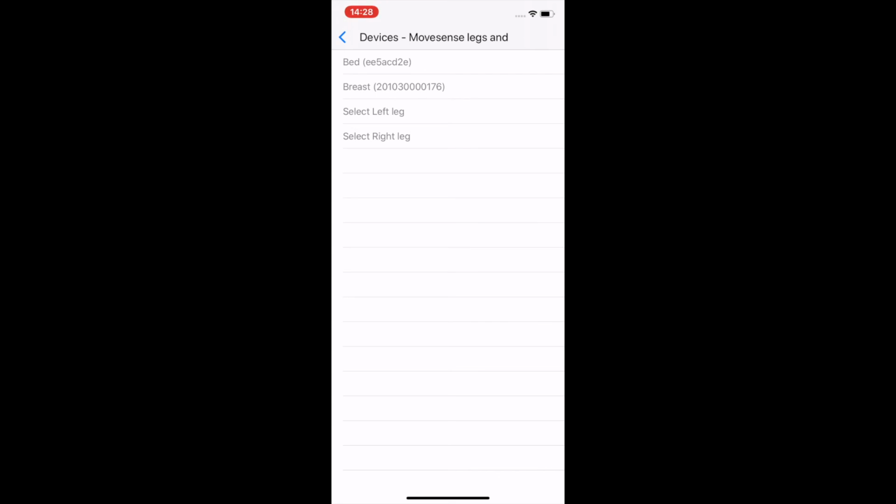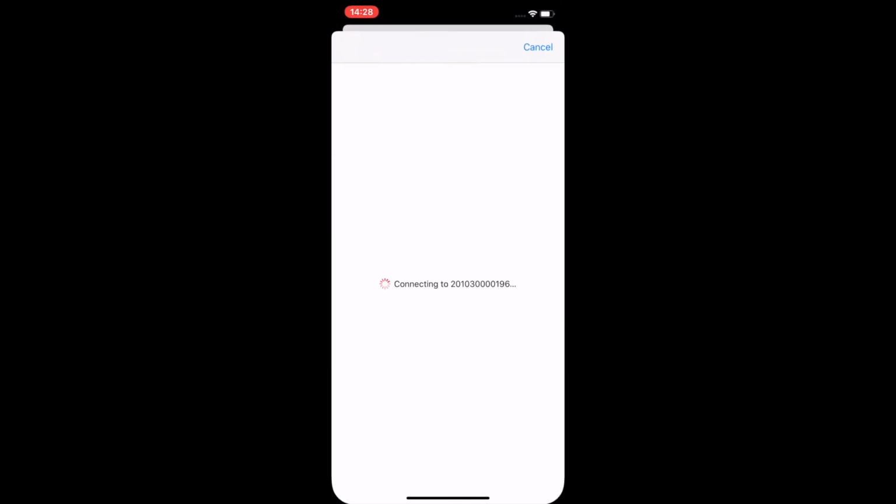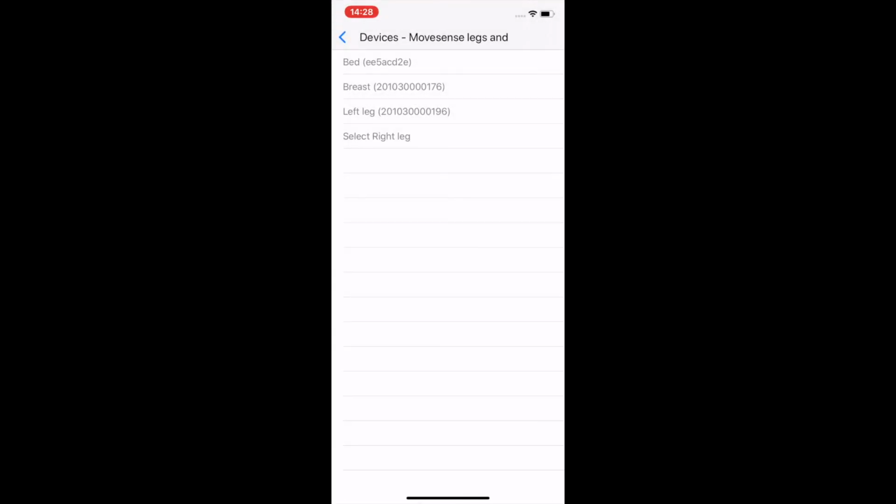Now we have to put a sensor on the left leg, and then after that we choose the sensor as well to get the data from the left leg. That's pretty much done now. And here we go, that's the sensor now. And next, the right leg. So we have the bed sensor, the breast sensor with ECG, the left leg with linear acceleration and gyroscope at 416 Hz, and the right leg will now come as well.